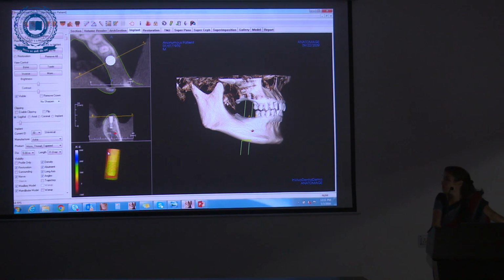And in this view, the colors around the implant show the type of bone available around it. White is the highest bone density and black is the bad news, or maybe red or maybe orange. That bone may not be good for holding the implant, and then you have to plan something different for that treatment.